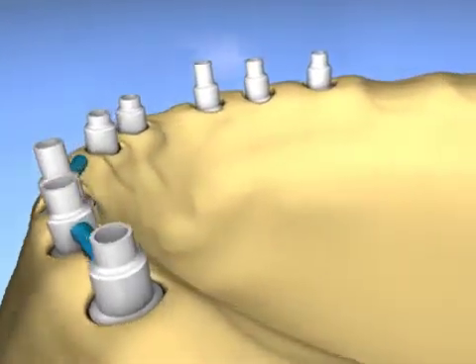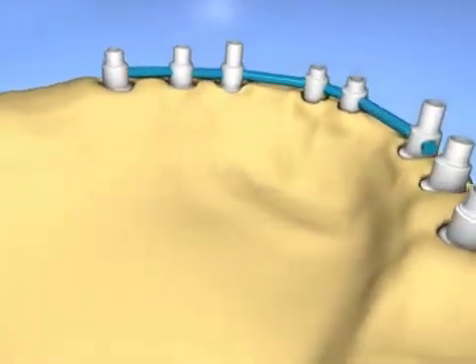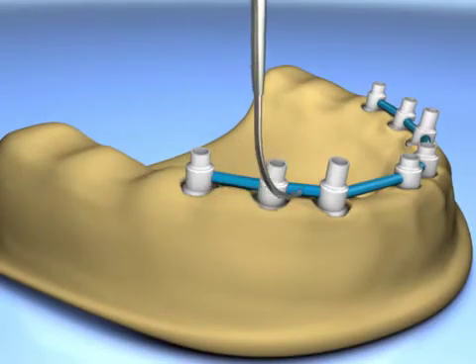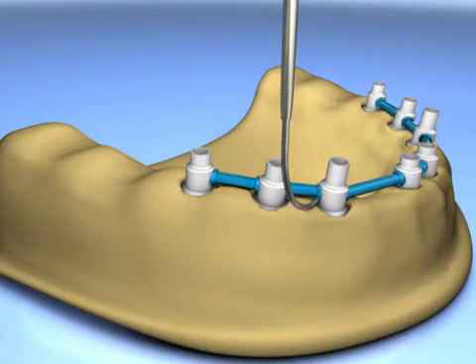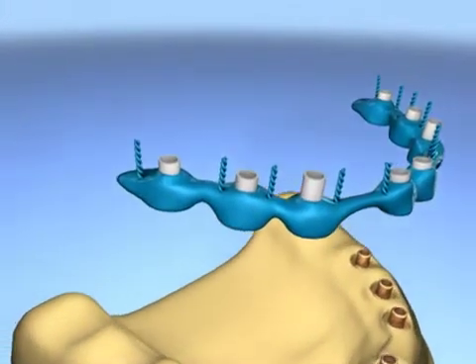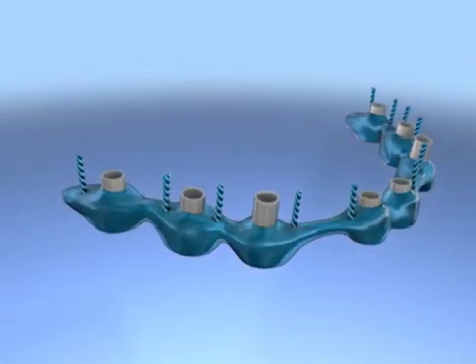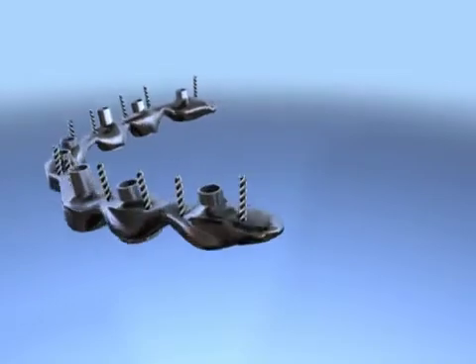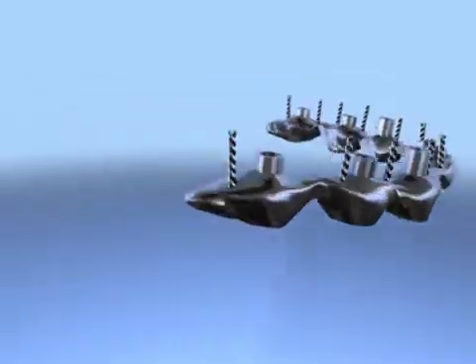The wax-up is then started and is formed to define the framework of the prosthesis. In order to cast, the entire supra structure is unfastened and carefully removed. It is then invested and cast in non-precious chrome cobalt alloy. This is the cast structure after it has been polished.